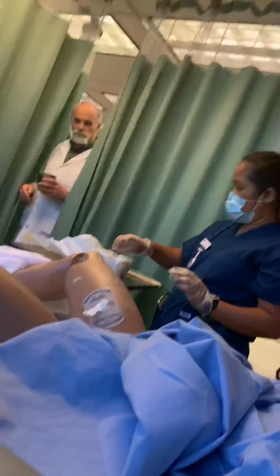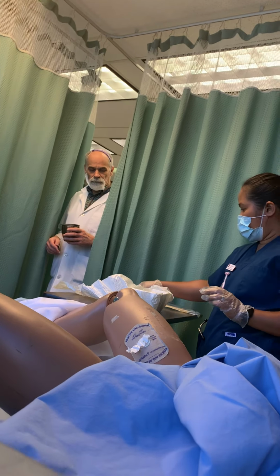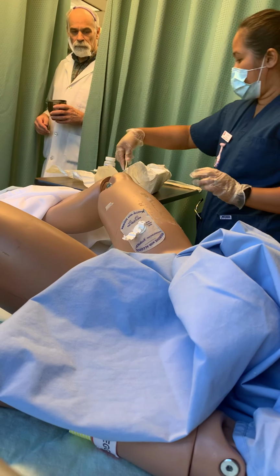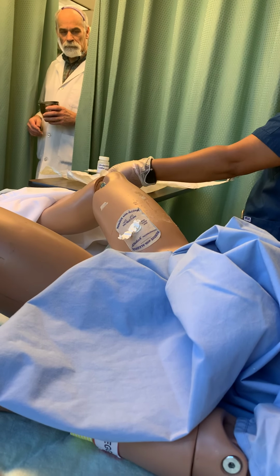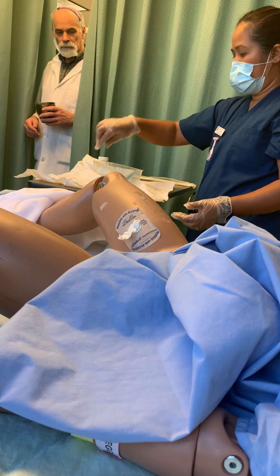I open this away from me first, and then side by side, making sure to avoid contamination. Do not bend.